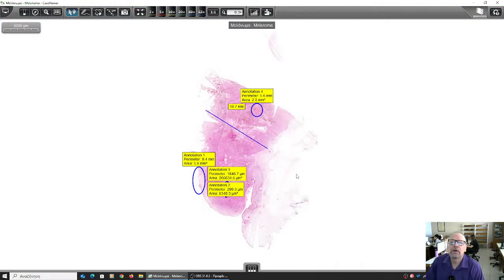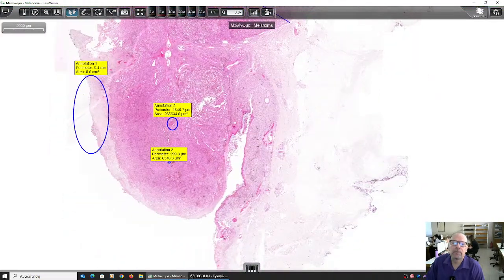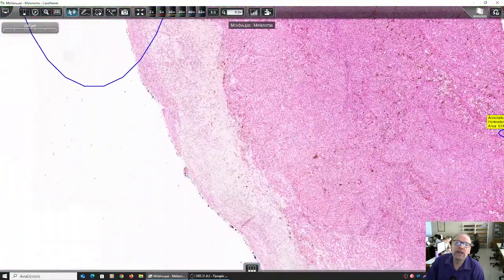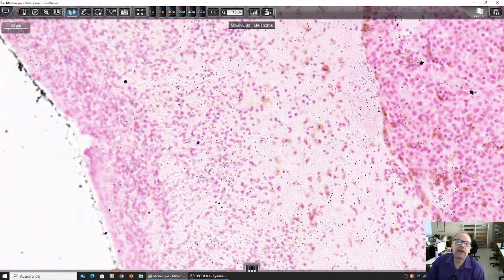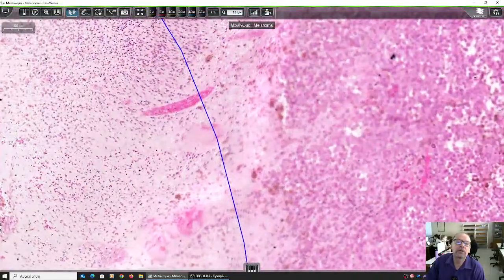And our last case, what's happening here? This is a lesion protruding from the epidermis. Look what it has done on the surface. There is no epidermis. What has it done? These are necrotic cells. So this is an ulcerated lesion.